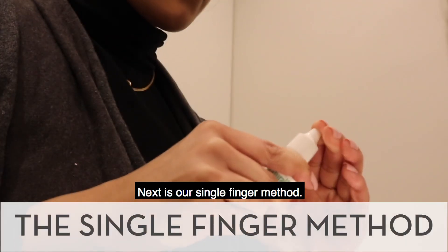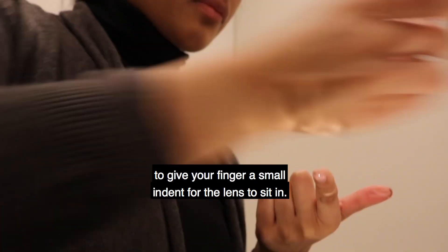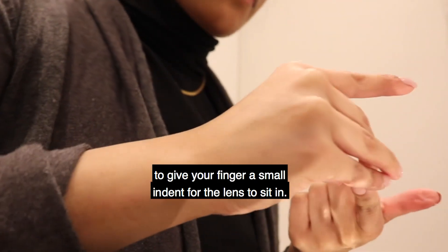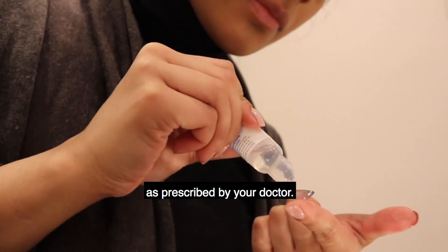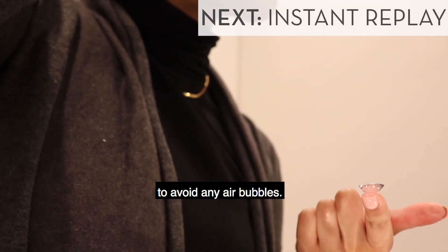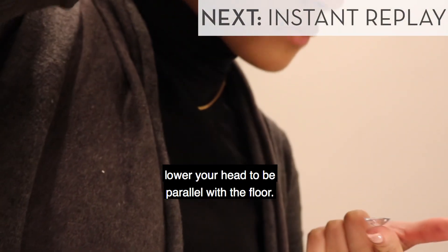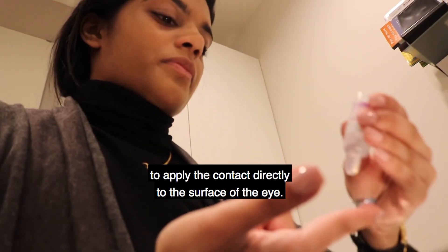Next is our single finger method. You can use the top of a bottle cap to give your finger a small indent for the lens to sit in. Once balanced, fill the contact with saline solution as prescribed by your doctor. Make sure the bowl of the lens is completely full to avoid any air bubbles. Using your preferred grip, lower your head to be parallel with the floor. It's easiest if both eyelids are open wide enough to apply the contact directly to the surface of the eye.